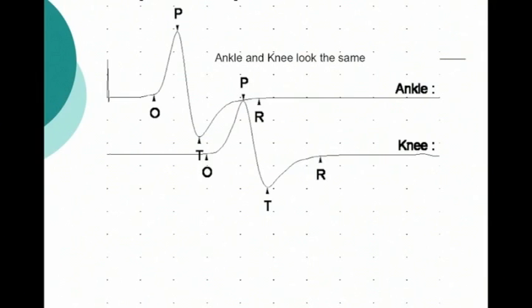But under those circumstances, if you increase the current just gently and gradually, you will start seeing when the response stops looking like it, or when the response doesn't grow anymore, or where the response immediately jumps to a different response, that you're now stimulating another nerve. We'll talk about this later.